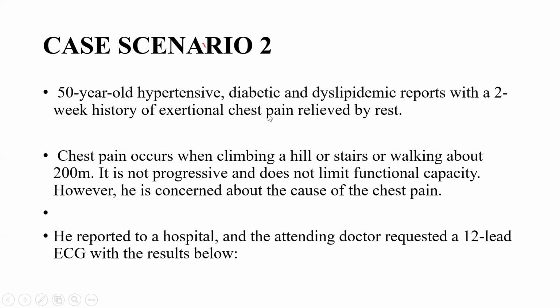Okay, so come again, what are you supposed to see on the stress test that makes it positive? The gradient will increase by more than 15 millimeters of mercury. Okay. And your pulmonary systolic pressure will go above 60. Okay. It's clear. Thank you so much.